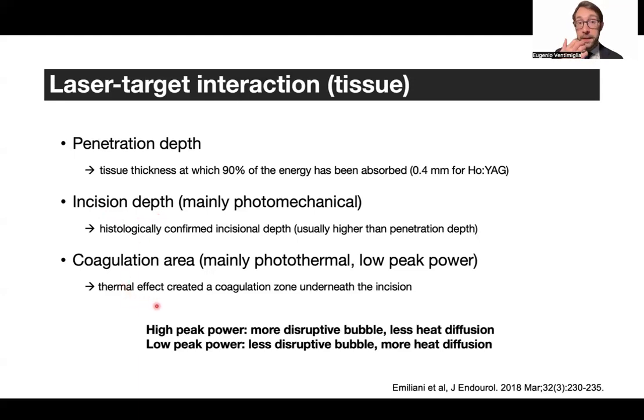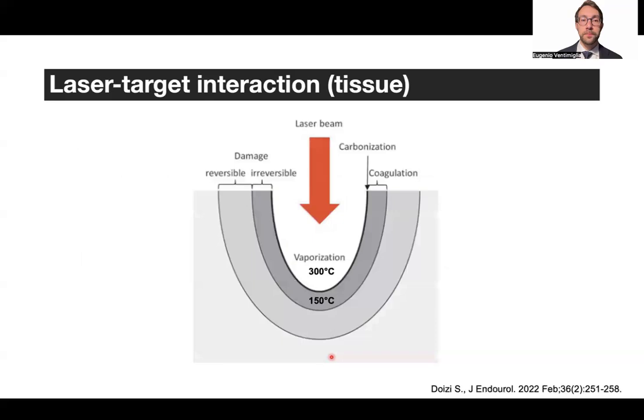And keep in mind that high power lasers, which emit very big and explosive bubbles, will be really good at incising the tissue, but at the same time, due to the less gentle delivery of energy, we will have a less important coagulative effect. Whenever you have a low peak power, it means that you will have a less disruptive bubble, but at the same time you will have more heat diffusion and better coagulation.